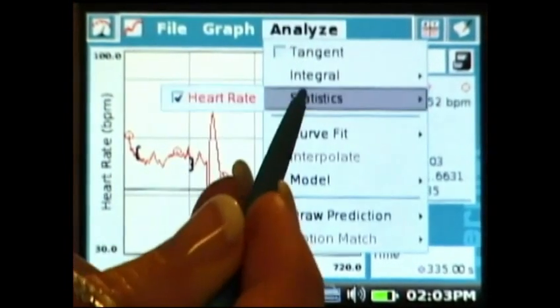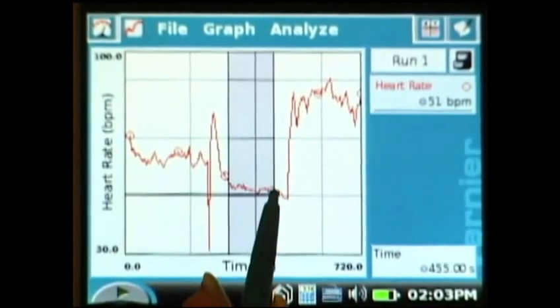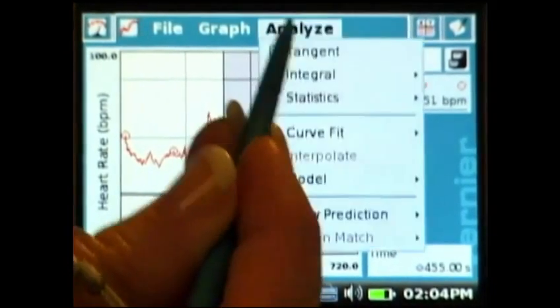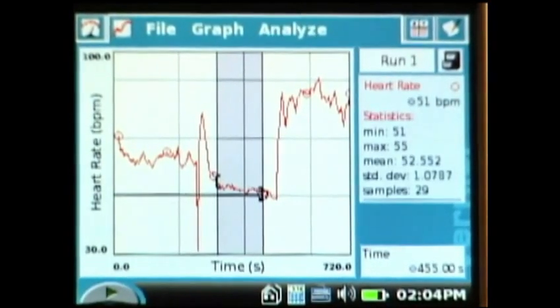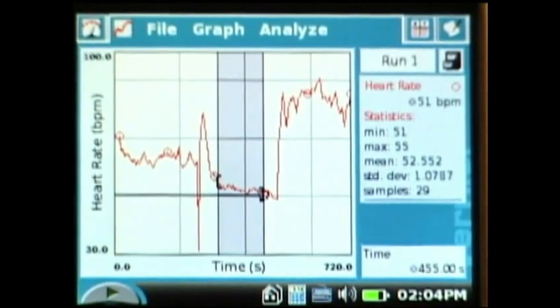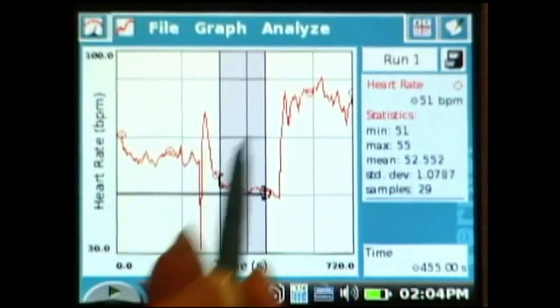The second section, if I turn the first one off. Second section I'll select a region where he's lying on the floor and calculate the statistics of the heart rate there and the average is down to 52.5 so we'll round that to 53 beats per minute during the part where he was lying on the floor, so quite a bit slower.